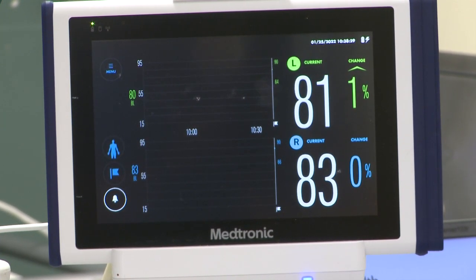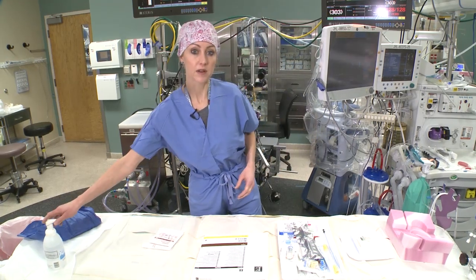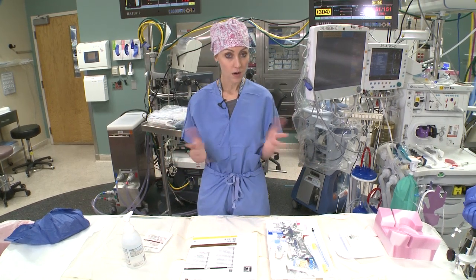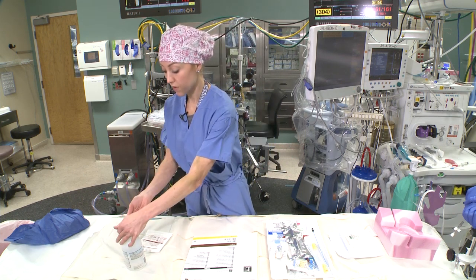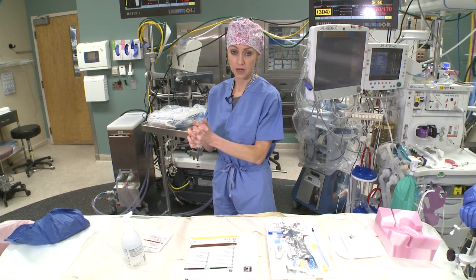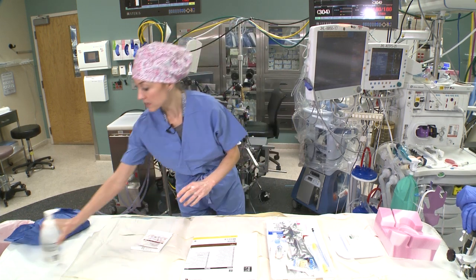Our next step is we're going to go over sterile technique and swans. This will be the last part of this video — we're going to go over sterile technique, how to place your swan, gown and glove, your lines, all that. First, make sure all jewelry is off, everything off from around your neck. When I go over how to gown and glove, I do this in a way that you don't need anyone else to help you, just in case the nurses or somebody else is tied up. Wash your hands.